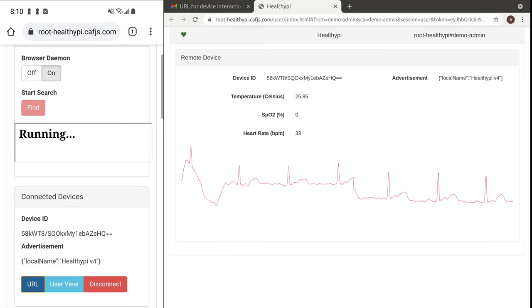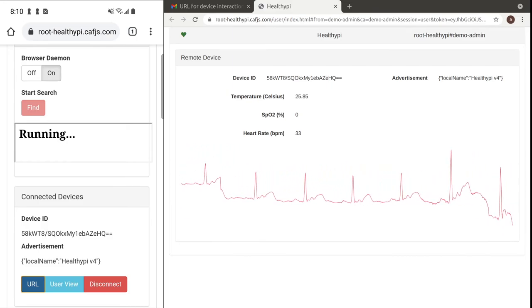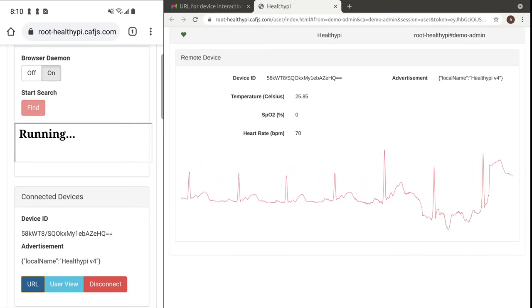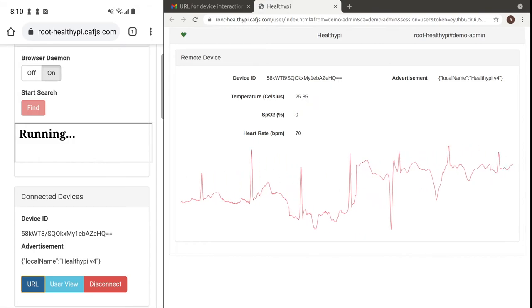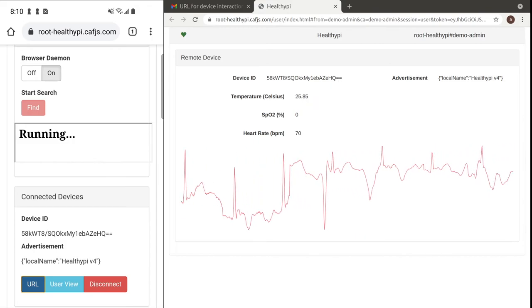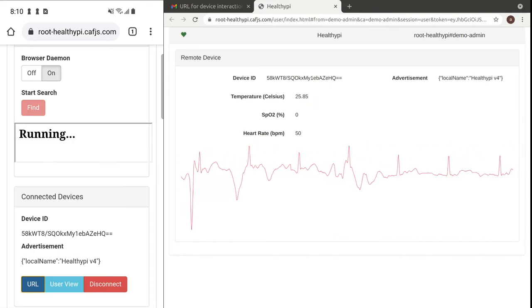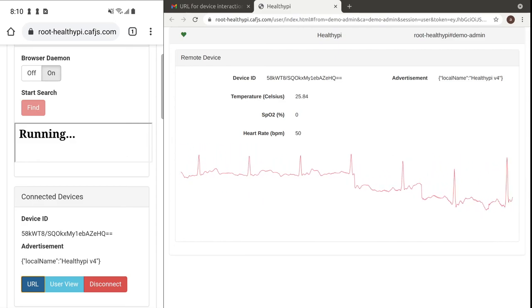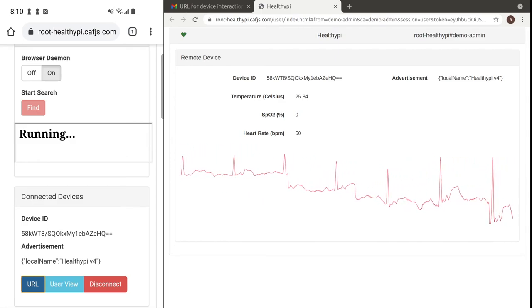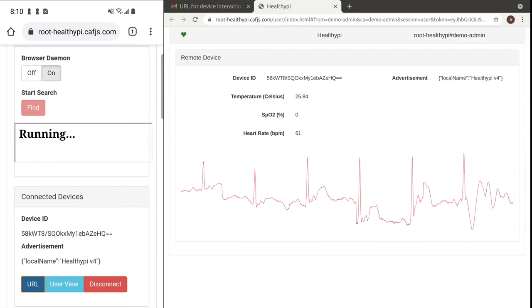What about security? The URL contains a short-lived credential so that only the doctor can connect. And in any case, I could revoke access at any time too.